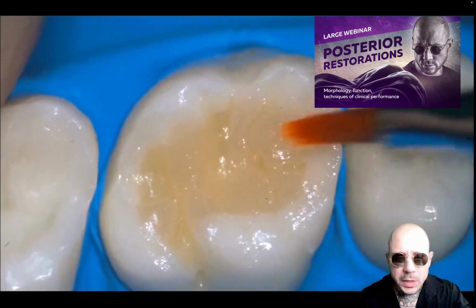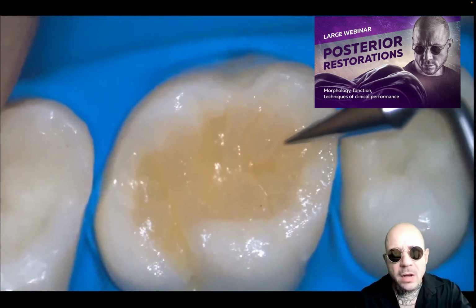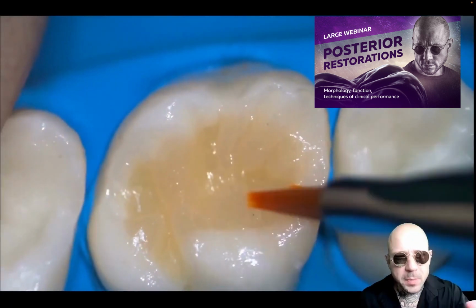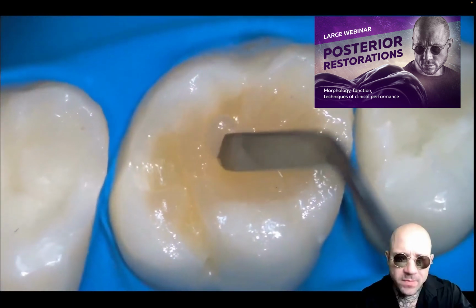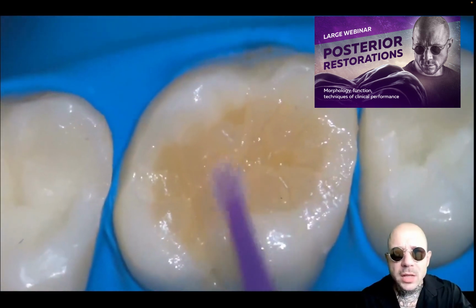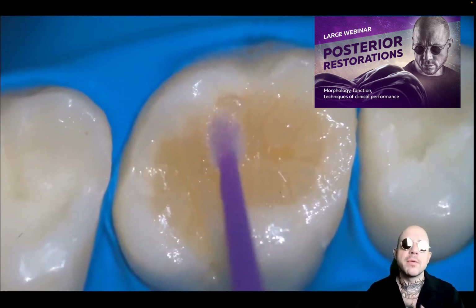More frequently I use a paintbrush, as you can see, because after adjusting the central ridges in place, the spaces between them will be much narrower, and an instrument such as a micro brush is very convenient for shaping, but it's not thin enough for shaping in a narrow area.